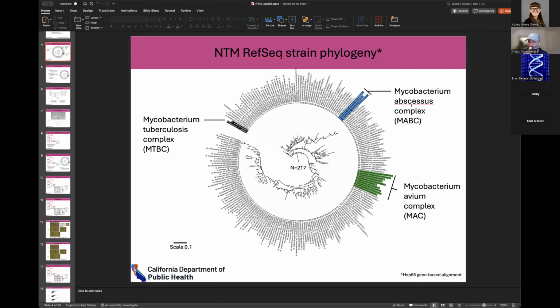Okay, that's fair. Because you could test, I would think, at three steps: either the primary specimen, like sputum specimens that you're getting in, or once you have original growth out of the MGIT tube, which could potentially still be mixed, or after you've actually grown it back out on plates. So I'm just curious where you guys are testing. Yeah, I can't say for sure. Sorry. That's fair. Thank you.